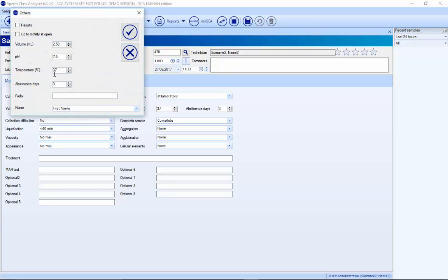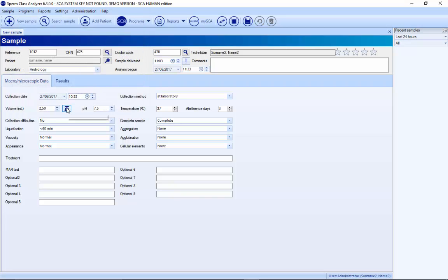Here we have the different default values and you can change them. For volume, if you have a scale connected to the system and press this button, the volume will be entered automatically. It's also possible to print the slide label if you connect a printer, or print the container label.